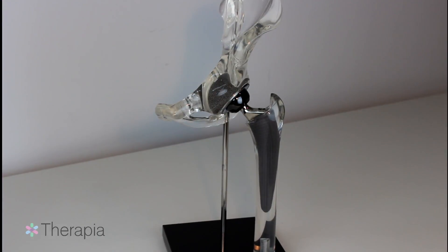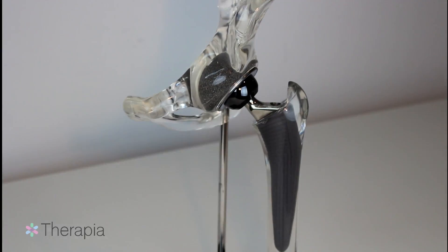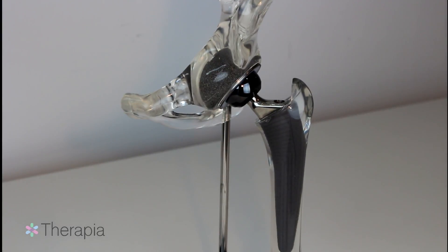An uncemented total hip replacement with a metal on polyethylene socket is the most common procedure performed in North America today. In this model, you will notice that a total hip replacement has been performed to replicate an actual hip joint replacement.